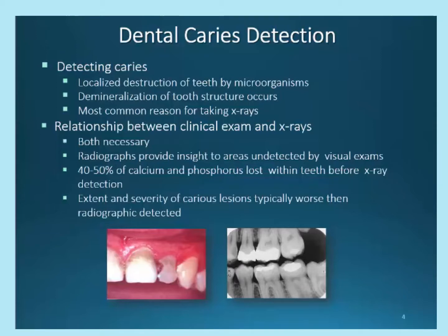Identifying dental decay requires both a clinical exam and radiographic exam. And due to the nature of a two-dimensional image from a three-dimensional object, the oral exam can detect lesions not seen on radiographs. This holds true for radiographs identifying images not possibly seen visually.